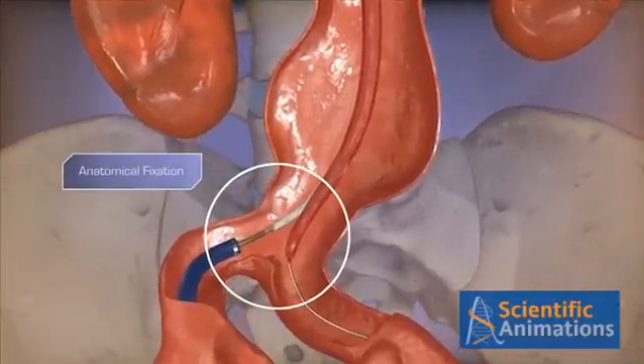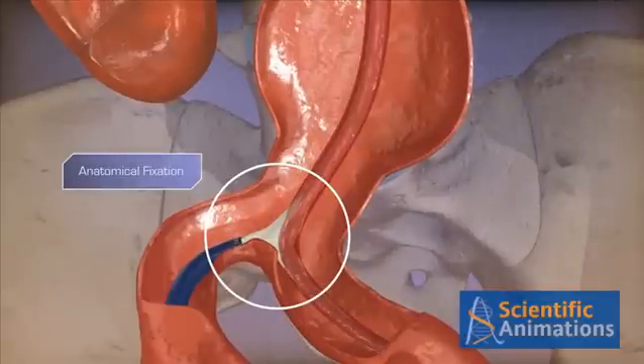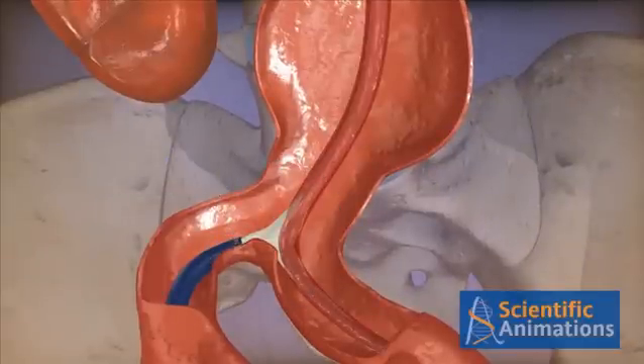Now, bring the device down to seat the main body on the native aortic bifurcation. This technique, referred to as anatomical fixation, provides a firm foundation to inhibit distal migration.